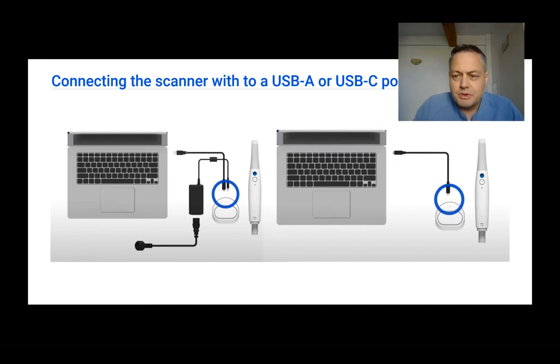USB-A ports are not delivering enough power, or power at all, to the scanner or to the scanner base so that it can work properly. So if you are going to use a laptop with only USB-A 3.0, you will also need to plug the scanner or the base into a wall socket, because power is going to come from the socket and information is going to flow through the USB-A cable.